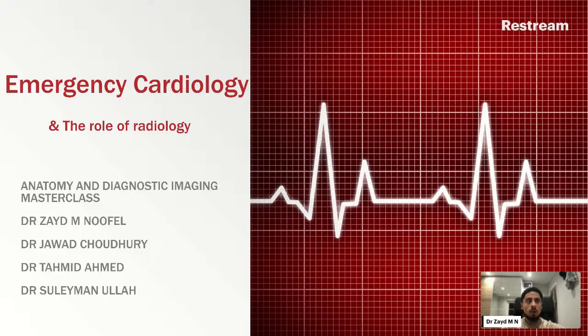So we'll be going case by case, and I will start with presenting you a case. You will present me with what condition you think it is, what diagnosis you think it is, and possible management, and then we can go through how this is a radiological diagnosis and how this condition is treated. Okay, so let's go ahead with the first case.